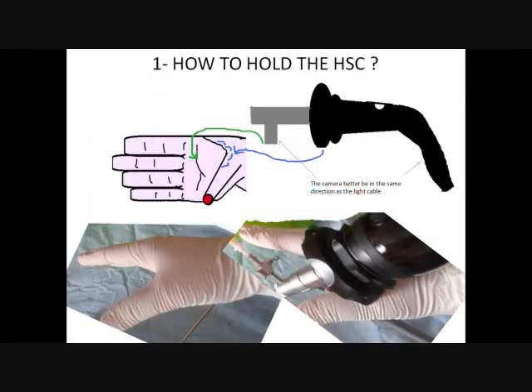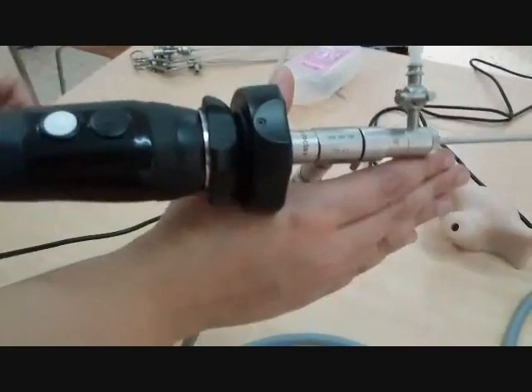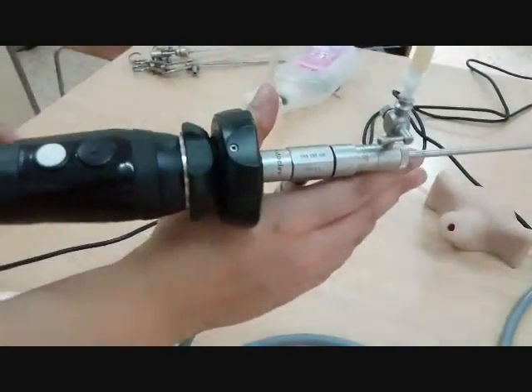First point, how to hold the hysteroscope. I suppose there is more than one way to hold it. In this demonstration, I'm telling you about the one I learned from the person I'm very grateful to in this matter. So take a look at my hand and the hand drawn in this picture. It looks like it wants to shake hands with somebody else. It's as if we wanted to shake hands, but with the hysteroscope. See my hand, as if I wanted to shake hands with someone, and I put the hysteroscope just on it like that.